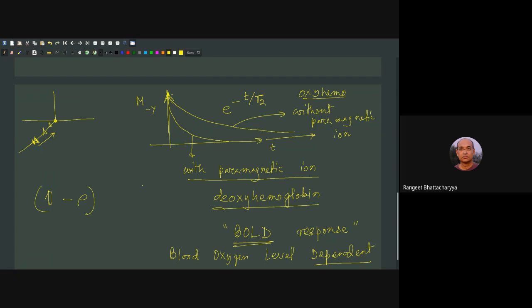Actually, no. What is important is some sort of image. We do not look explicitly at where the gray matter is and how the small things change. What we look at is whether there is a big blob like a tumor, or some kind of lesion, some damage. Whether they come up with a bright color or dark color usually doesn't matter. As long as it is different from the control image, we say, okay, there is something. That is normally what we do.